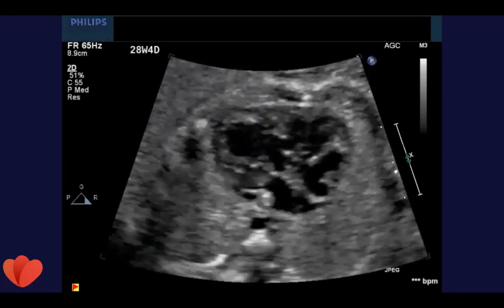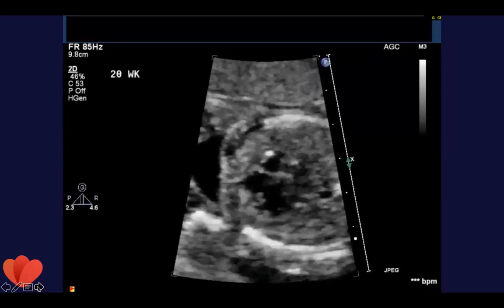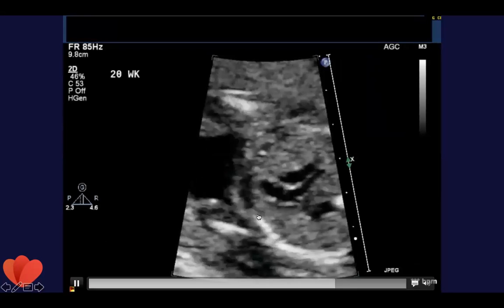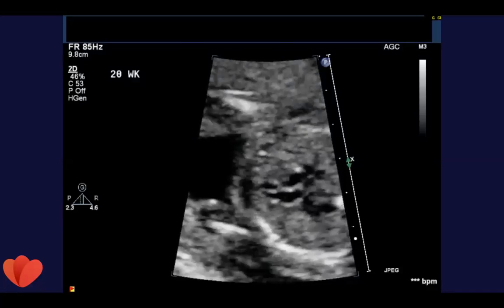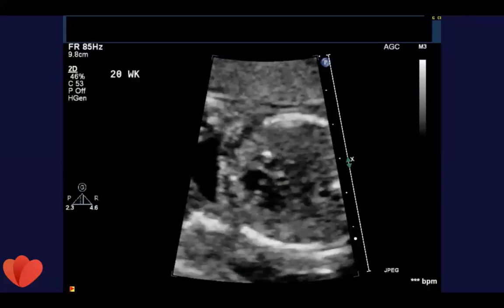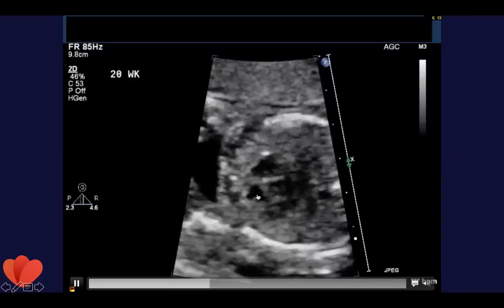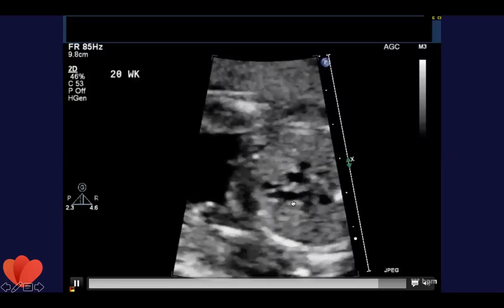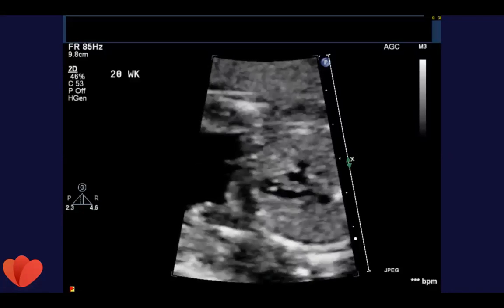So now that we've identified where the right ventricle is, we need to work on the great vessels. So in this sweep, you can see as you sweep up, just like in the patient with tricuspid atresia, it's normally related great arteries. So you can see here is the small right ventricle, and a pulmonary artery comes out of that right ventricle. So it's normally related great arteries.